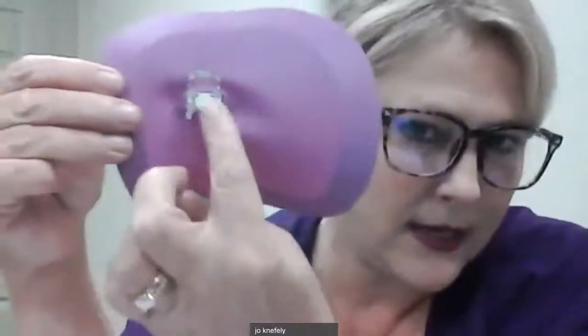It goes over the mouth, and this is called a rubber dam clamp. And only the tooth that they're working on would be exposed. So the tooth would stick out of the clamp. And that way, it helps prevent any of the splash or splatter, the aerosol, the droplet infection.